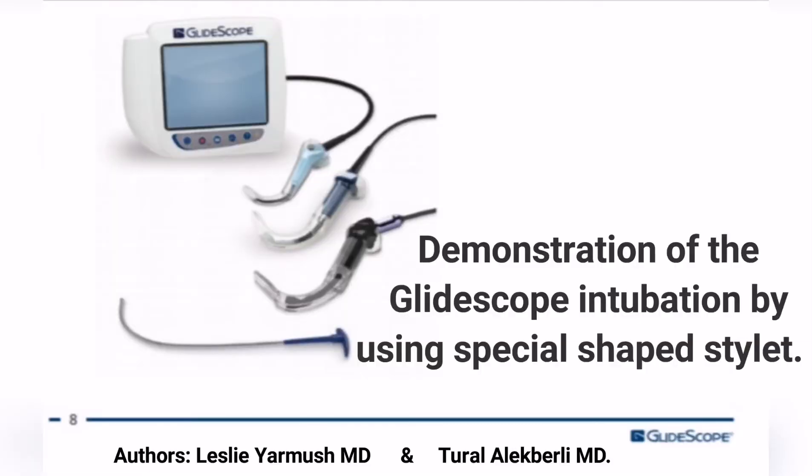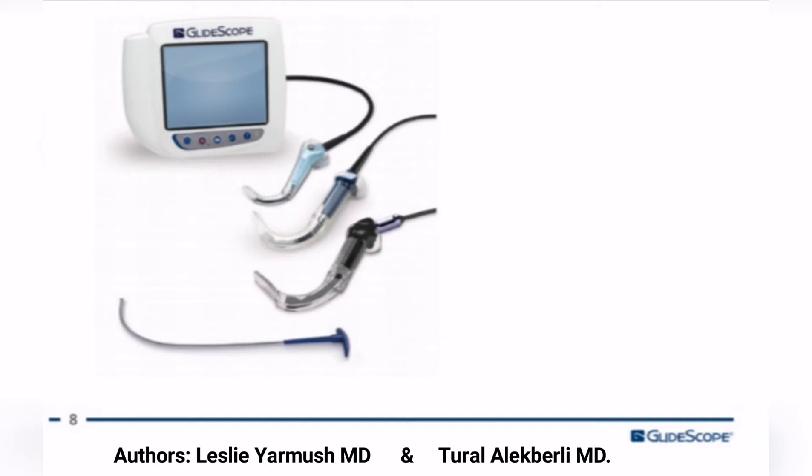This video is a demonstration of the GlideScope video laryngoscopy intubation using a new technique with a special shaped stylet. The aim is to improve the video laryngoscope technique and increase success rate, especially in expected difficult intubation cases.